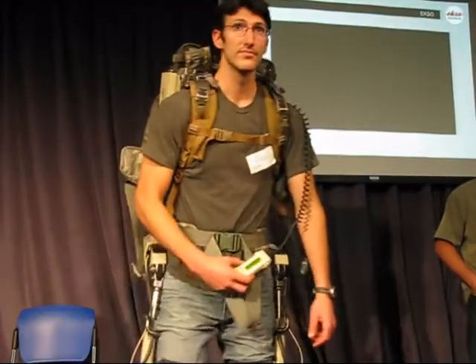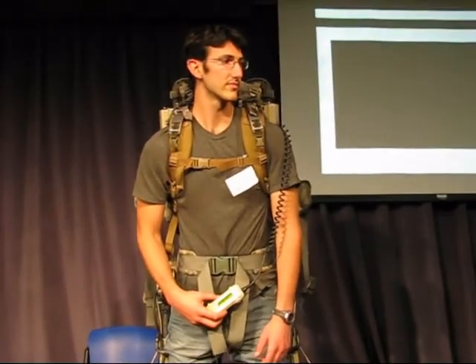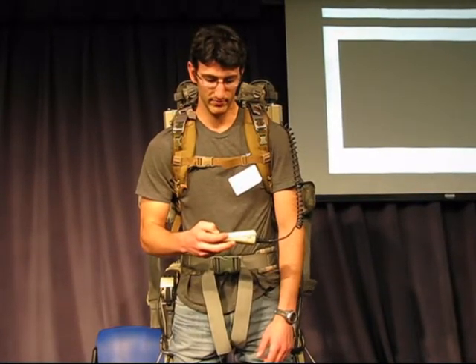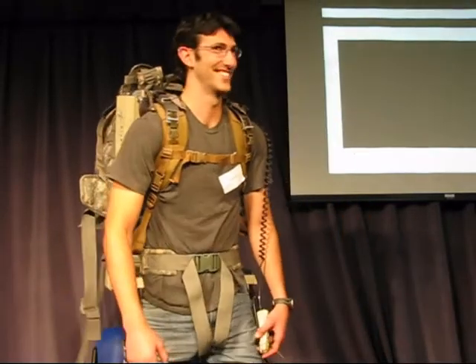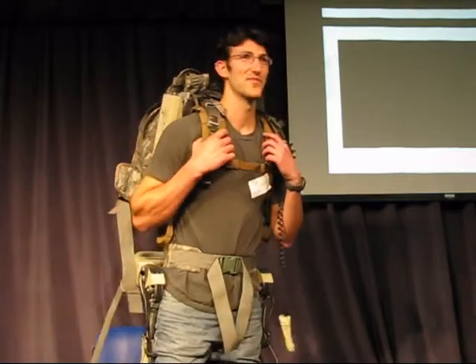How fast can you walk or run? So the top speed that we can really assist you at is about 7 miles an hour. You can overspeed it and go up to 10. But I'll caution you, running at 10 miles an hour with 200 pounds on, you need to be looking for where you're going to stop.